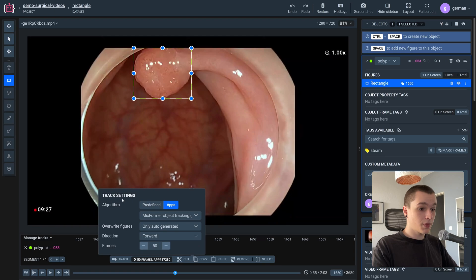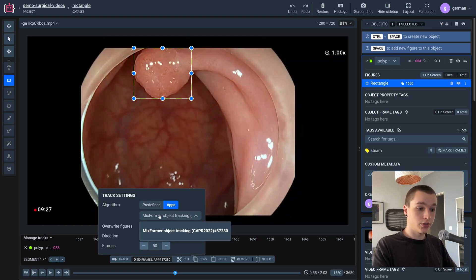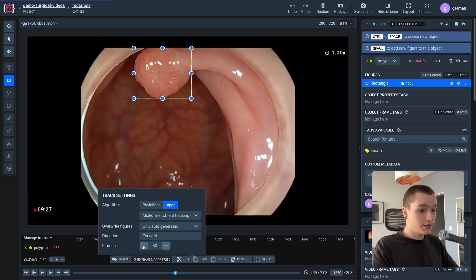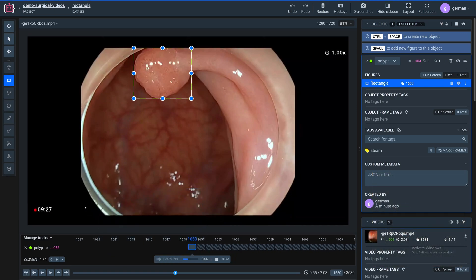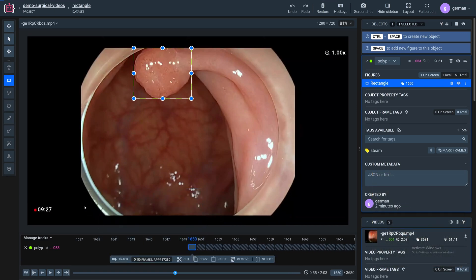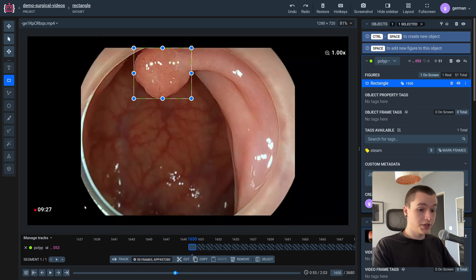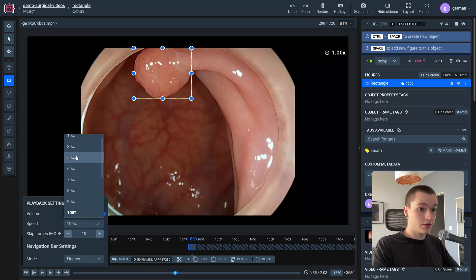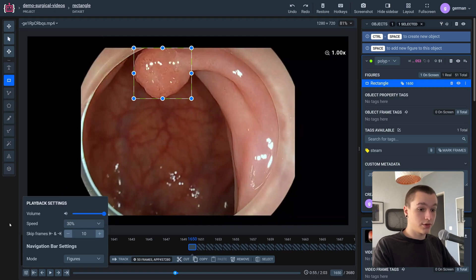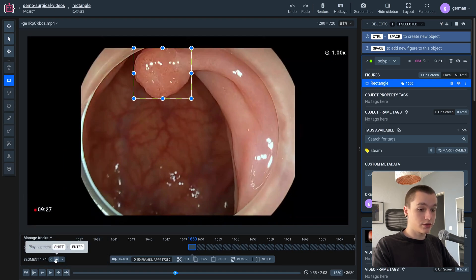Let's press the Track Settings button and select the object tracking neural network that we deployed earlier. Let's adjust the number of frames that we need to track — I'll leave it on default. Let's press the Track button. The tracking process is complete. Let's see the results. I'll adjust the playback speed — let's set it to 30 percent and play the current labeled segment.